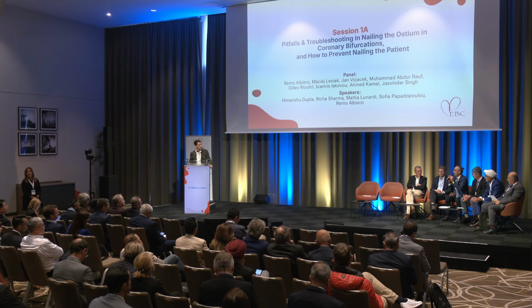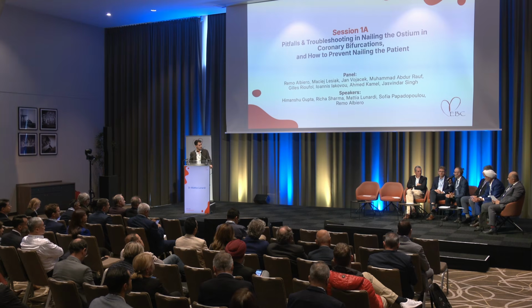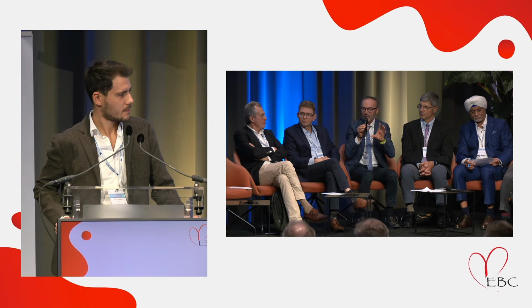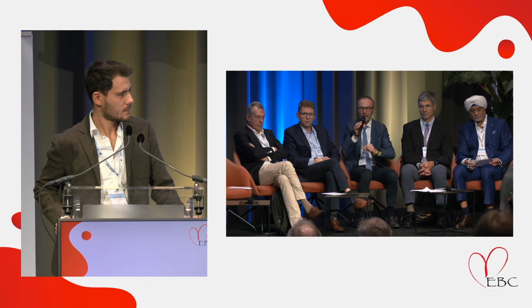It's because you have a proximal lesion, which is easily treated, and then you want to go to the ostium, very close to the ostium. But these cases are more difficult than to do a culotte. If you do a culotte immediately, you don't have any problem of stent thrombosis. But sometimes the most risky lesion are the proximal lesions that extend a little to the ostium, and then you want to nail the ostium.